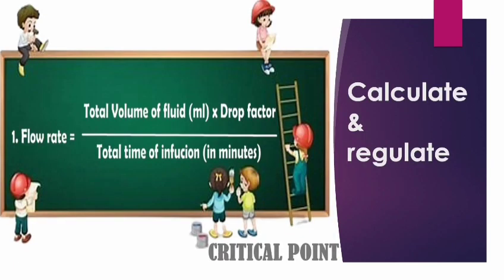As part of a critical point, you must calculate and regulate the flow of infusion according to the prescription. This is done to also restore fluid balance. The calculation is: flow rate equals total volume of fluid multiplied by drop factor, all divided by time of infusion in minutes.